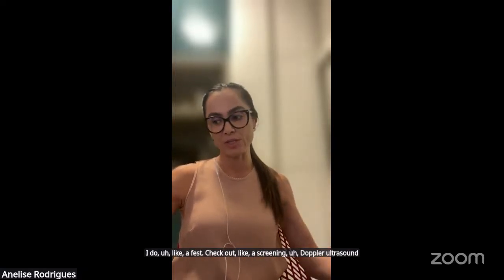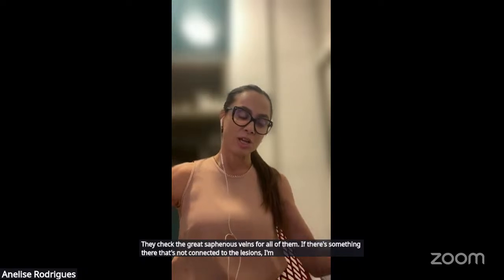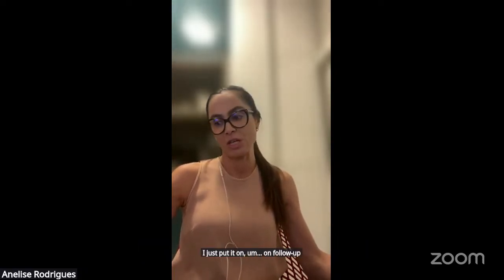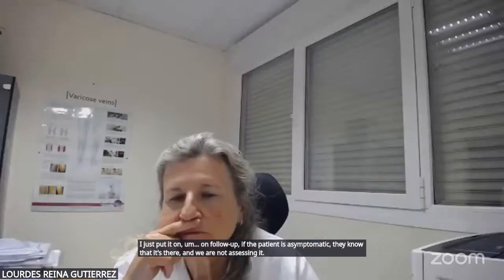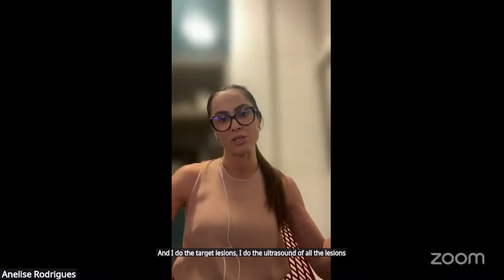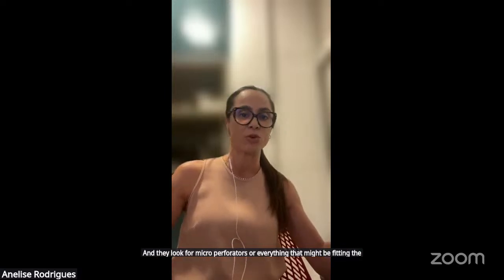I check the great saphenous veins for all of them. If there's something there that's not connected to the lesions I'm treating, I just put it on follow-up. If the patient is asymptomatic, they know that it's there and we are not assessing it. And I do the target lesions. I do the ultrasound of all the lesions. I measure the reticular veins that I'm treating, and I look for microperforators or everything that might be fitting the lesion before I start treating.